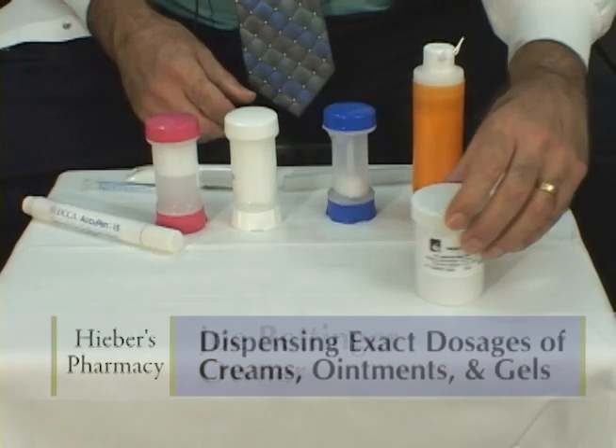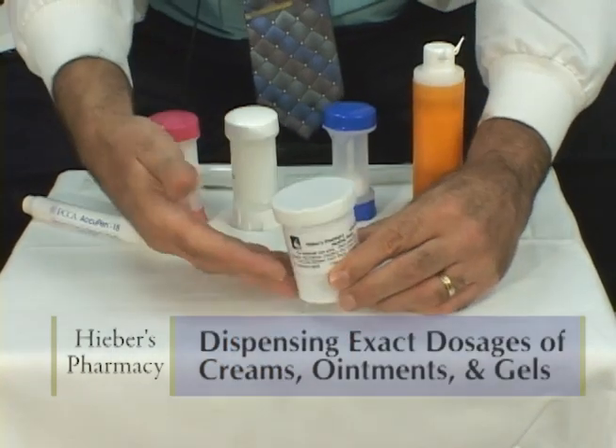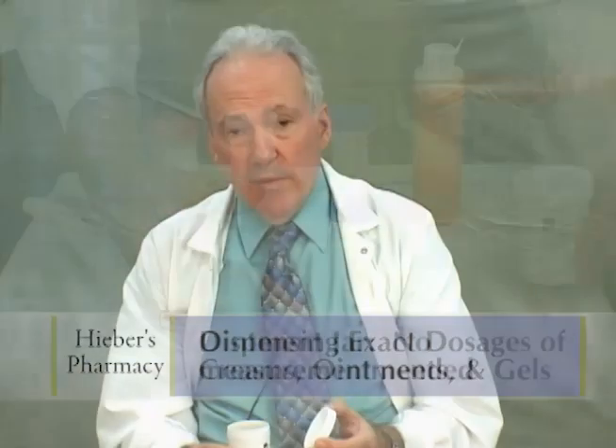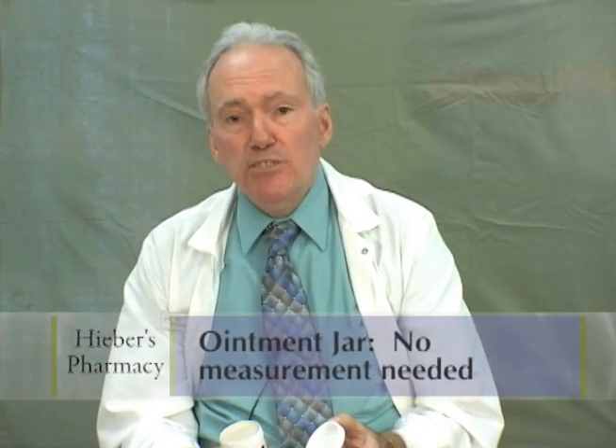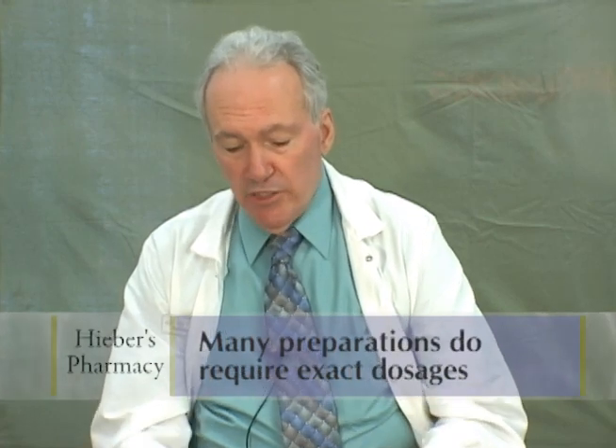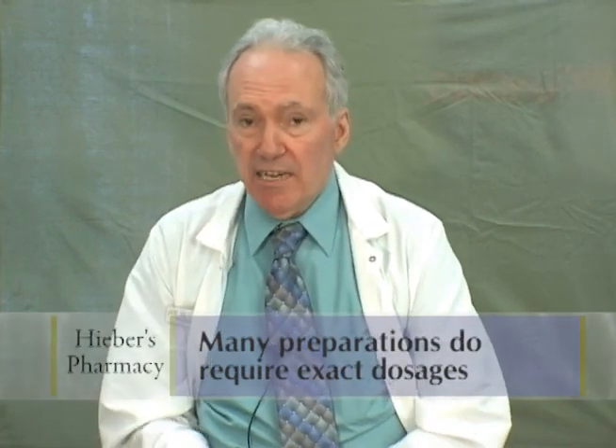I'd like to demonstrate a few different ways in which we dispense creams, ointments and gels. Typically you're familiar with the ointment jar — it's used for skin creams, diaper rash creams, ointments or pastes. There's no measurement needed, but many preparations require measurement so you get the exact dose of the active ingredient.